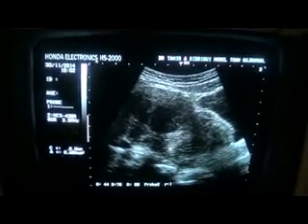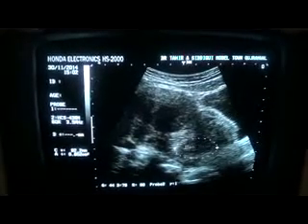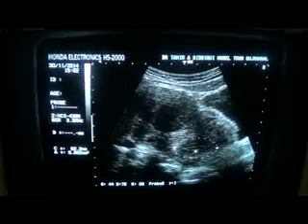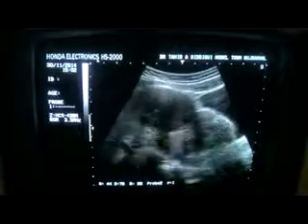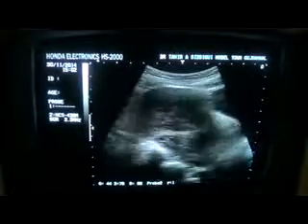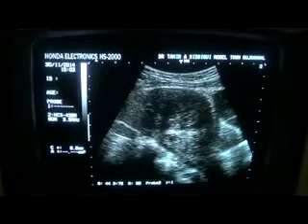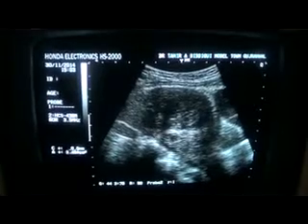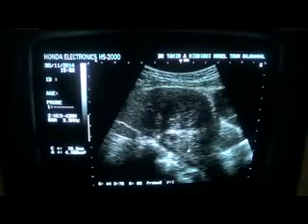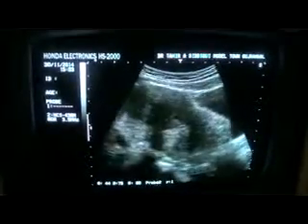Only this part of the uterus is clearly seen with the central clear endometrial canal, and that too is the lower segment. Upper segment uterus is not visualized with that clarity. Now this is the ovary. This is the right ovary with developing follicles seen within it.